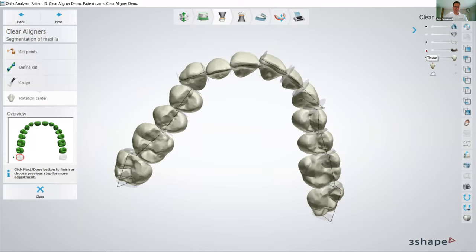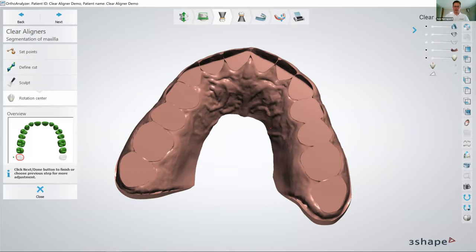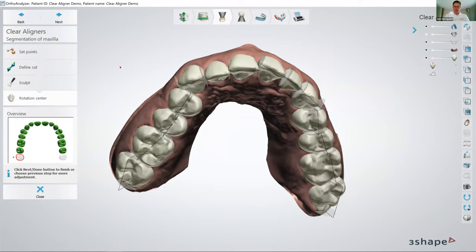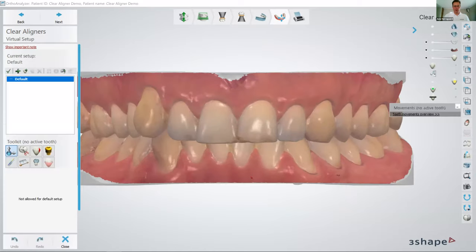So now you can actually remove the soft tissue, or you can also remove the teeth and look at the model like this. So it consists of four steps. You go through all the steps and then you click next. And then finally you get into the virtual setup. And at the end, you can print a report. So let's create a setup.